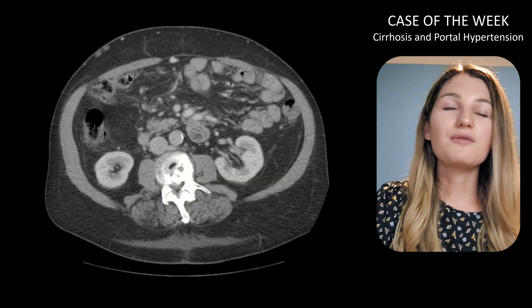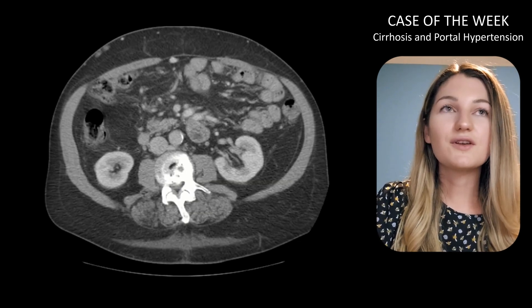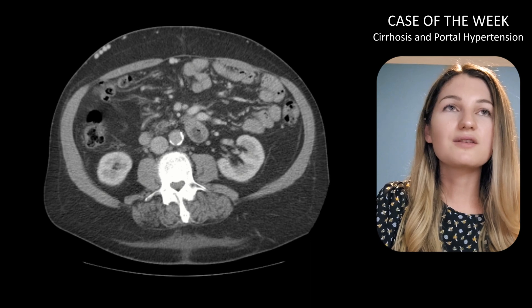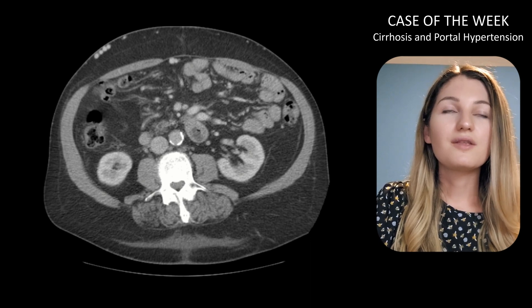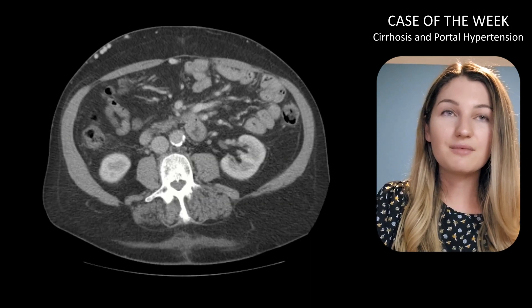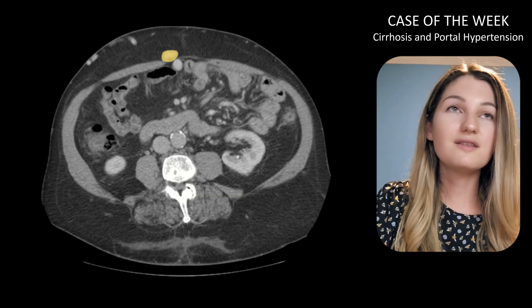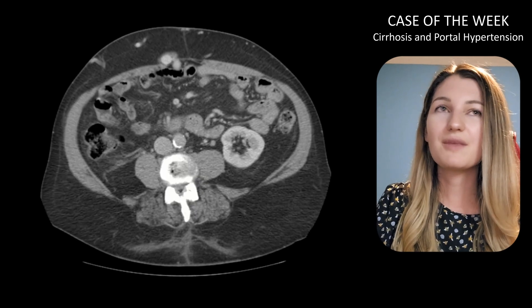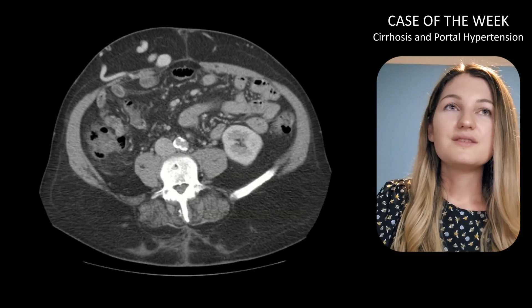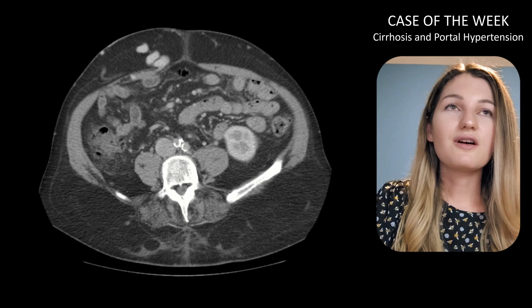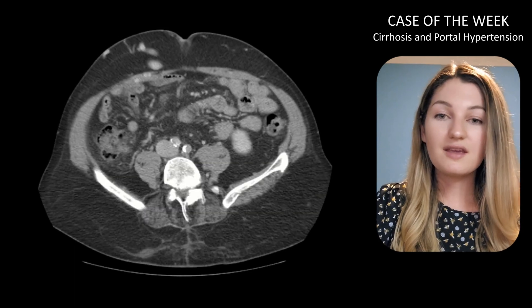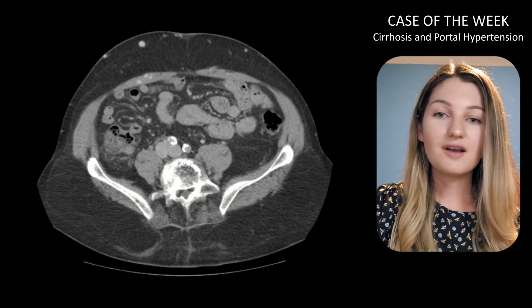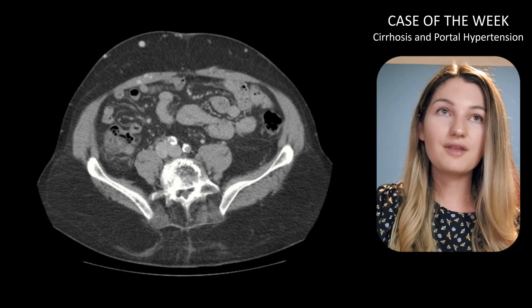Either way, this is abnormal. Following it inferiorly towards the umbilicus, we can follow this dilated contrast-filled varix through the anterior abdominal wall into the subcutaneous tissues — and this is what causes that classic appearance of the caput medusae, with dilated varices around the umbilicus.